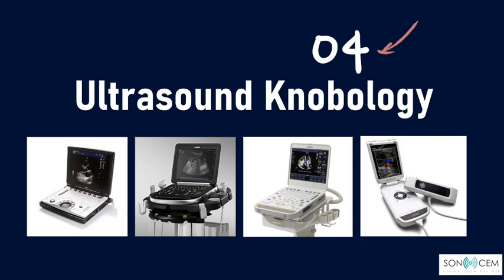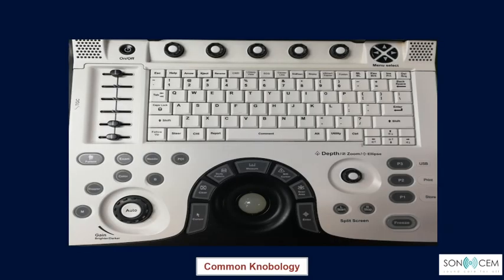Moving on to ultrasound knobology, there are numerous brands of ultrasound machine with different layouts of the ultrasound platform. Most of the machines display some common knobology. This is an example of a platform consisting of various knobs and buttons. We have the power button to turn the system on and off. This button may also offer options of putting the system into sleep mode or standby mode. The patient button to enter the patient's details or the operator's details.